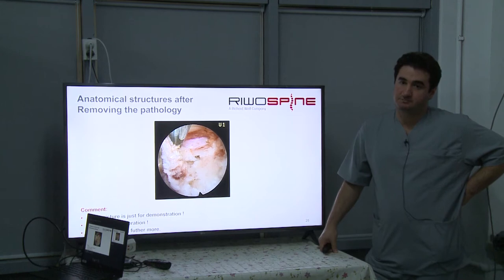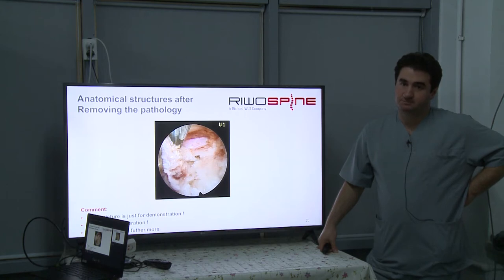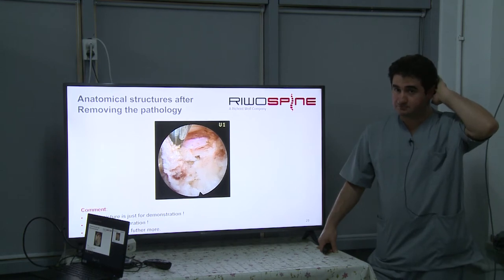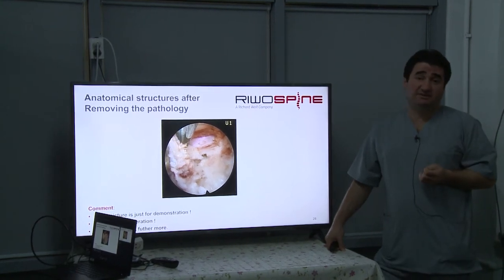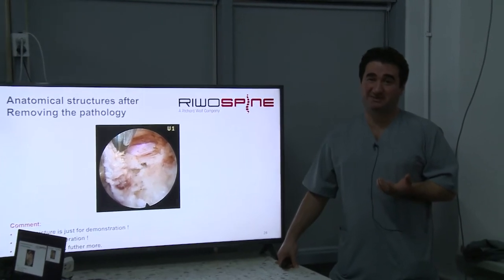And the first step is, when we go by the X-ray of the C-arm and without visualization, without endoscope, we just start to operate, and it's a little bit difficult for us, and for me, and for that reason I could have something wrong, maybe abnormal. It's better to start with the easiest case, not the scoliosis case. You don't need to treat the scoliosis case with the transforaminal approach at the beginning. These kinds of cases are always advanced cases, and when you get the experience, you can do this. Yeah, at the beginning, always start with the easiest one. Then when you get the experience, you can do the rest. Yeah, like every kind of surgery.